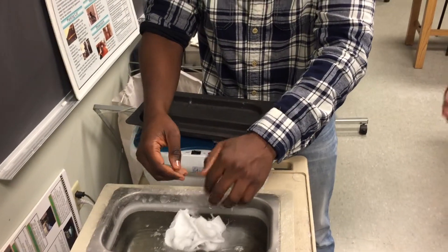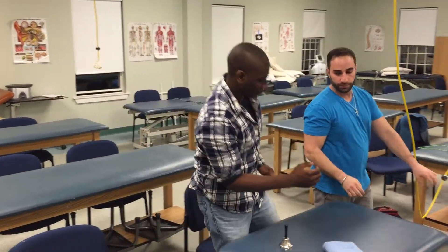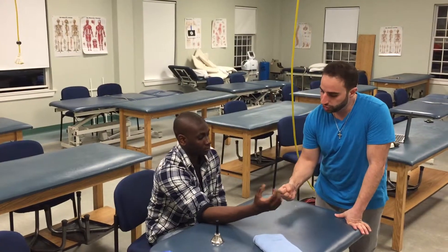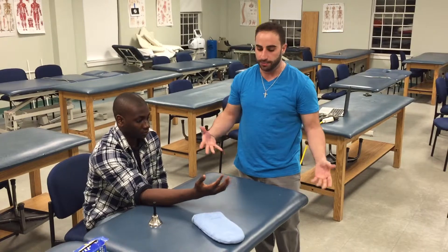Have the patient remove the wax over the paraffin bath. Once the wax is removed, encourage the patient to do their exercises while the hand is still warm — you can have them squeeze a stress ball or a tennis ball.